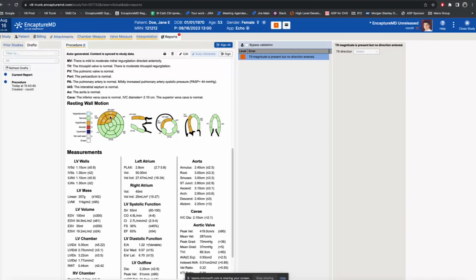One of the things that we always think about is, is the quality of the report important? And of course, performing the report and the accuracy of the report is very important. And we assist in that way as well, because we're doing the validation and making sure the report contains all the proper information. But in my opinion, it's also important to have a report that looks good, because especially if you're doing work both in the hospital and outside the hospital, the report is like your product. And so you want it to look sharp. The better it looks, the more professional it looks, the more likely you are to have more referrals, given even the same level of quality of the studies.